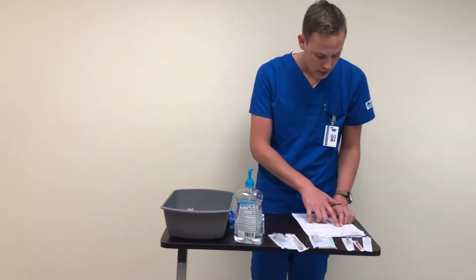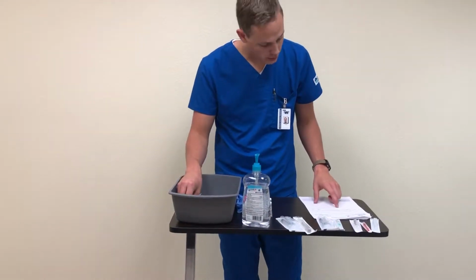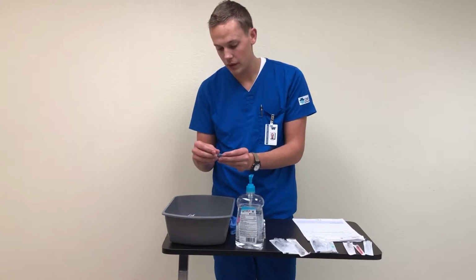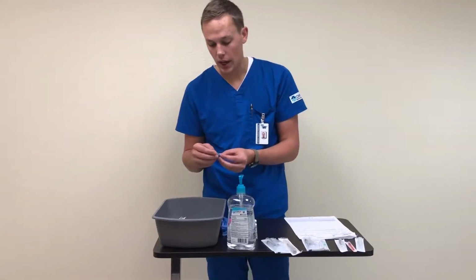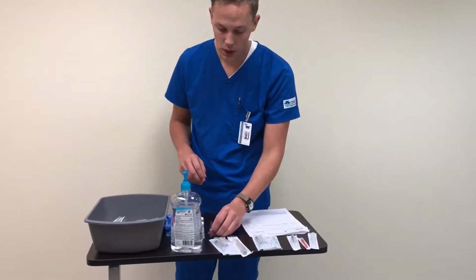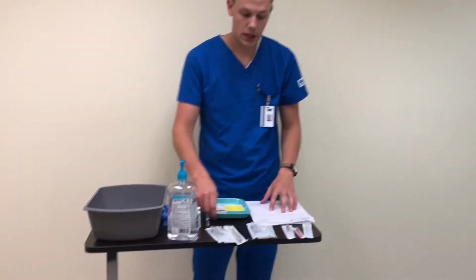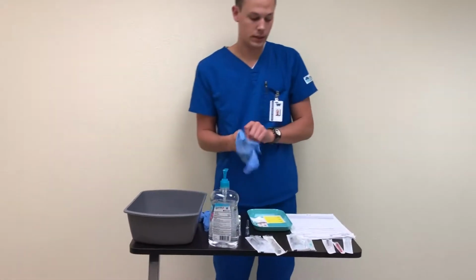And then lastly is that Phenergan, which is that promethazine hydrochloride, 25 milligrams. And here's that promethazine, and this is a single dose ampule, and it says that it's 50 milligrams per milliliter. And so I know through dimensional analysis that I'll just be drawing up half of a mil from this ampule. So that concludes my first med check, and so then I can go on to performing my second med check as well as drawing up the medications.